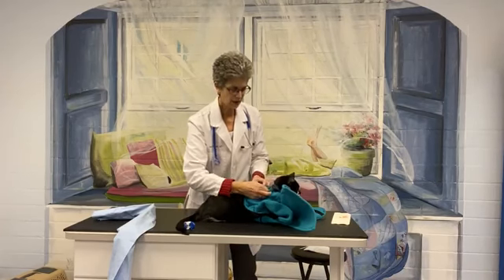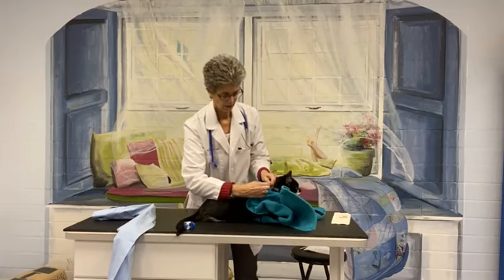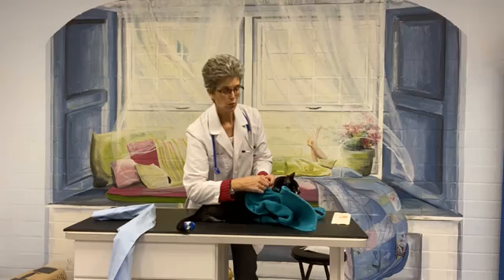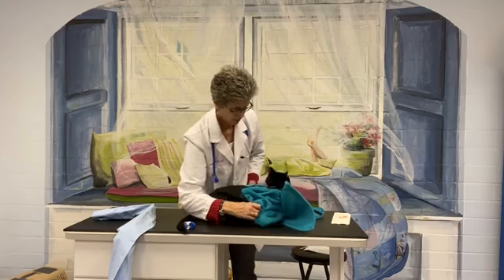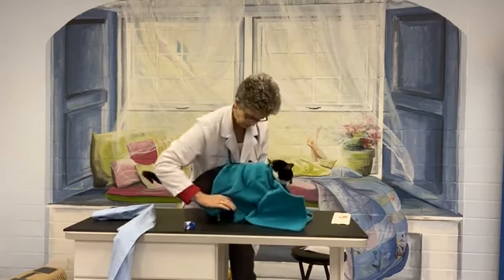So we first go around the neck. Now I'm going to take the two ends, and you see how I have my arm positioned against his body. It's my forearm that's helping to prevent him from jumping or going forward, so it's helping him to stay on the table. Now I'm going to go ahead and start the zipper, and with this part, I would just lift you. Yeah, I know, you worked yourself around a little bit.